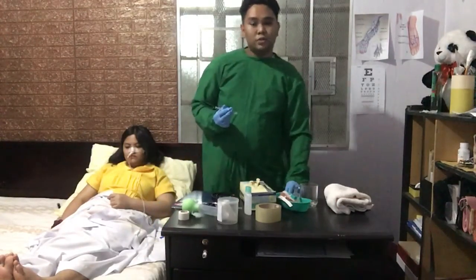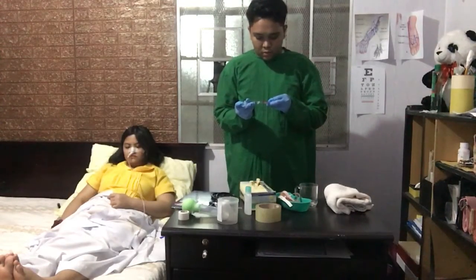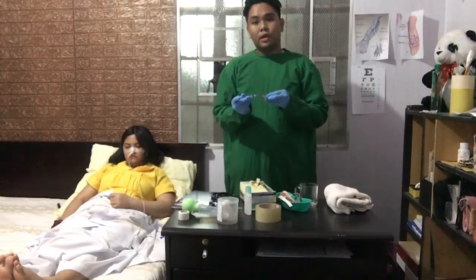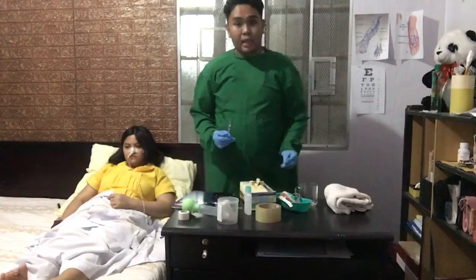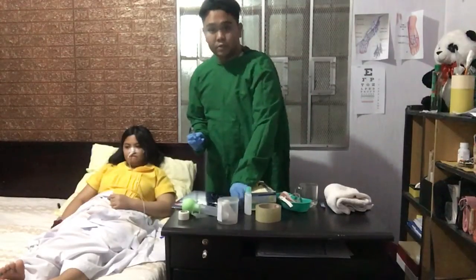After that, we will put it on the pH paper and compare the color according to the charting manufacturer. So we visualize the aspirated contents, checking for their consistency and color.